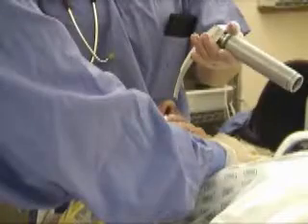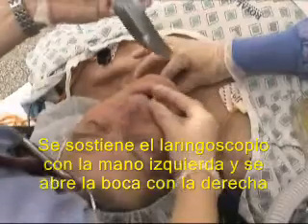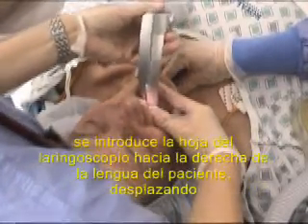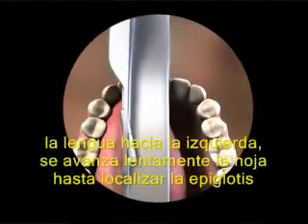Hold the laryngoscope in your left hand, blade down. Open the patient's mouth with your right hand. Insert the laryngoscope blade to the right of the patient's tongue. Gradually move the blade to the center of the mouth, pushing the tongue to the left.